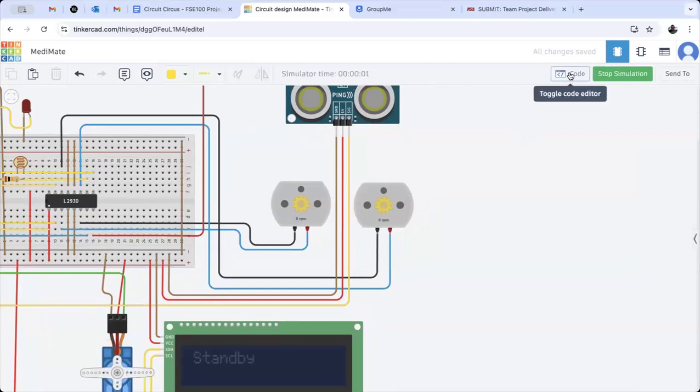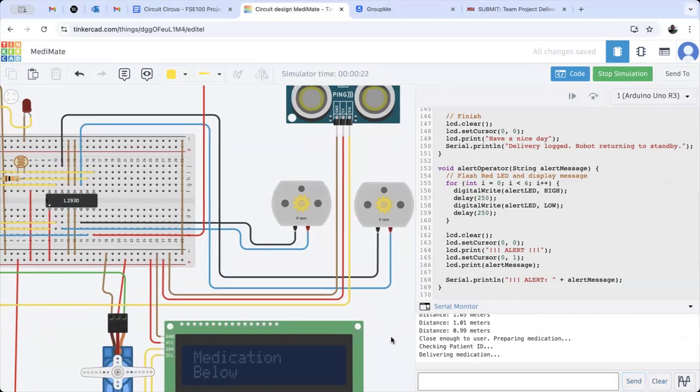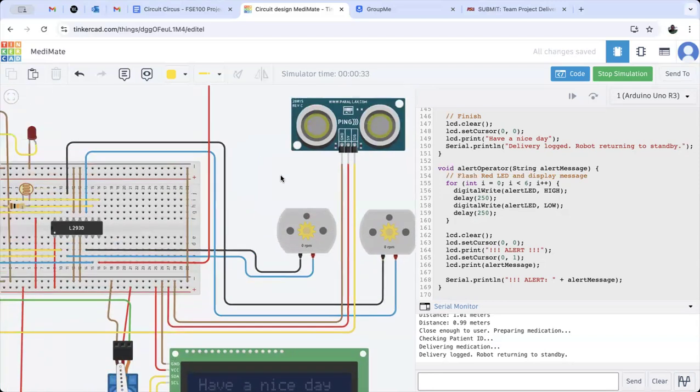So I want to start the simulation. It is on standby mode. I'm going to go to the code, and we're just going to do deliver, send. It's receiving the delivery command. It's driving. It gets to under a meter, checking the patient ID, and now it's delivering the medication. And we'll see this microservo start going off, and it has dispensed the pills. And you can also see that the motors have turned off now because it's in standby mode.